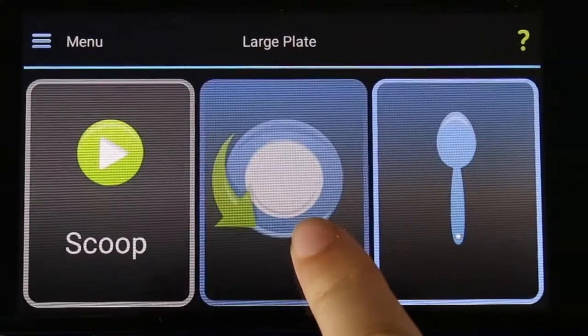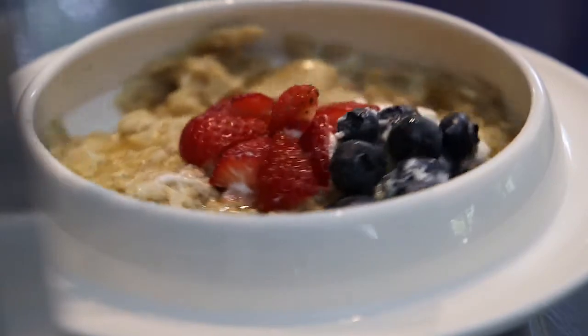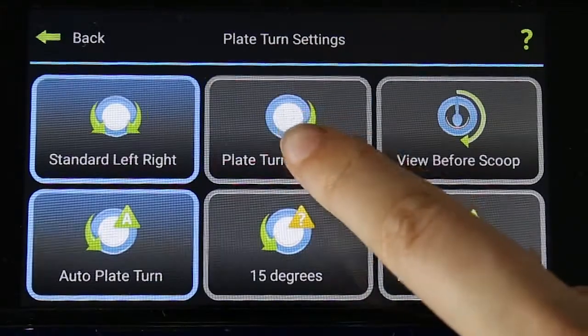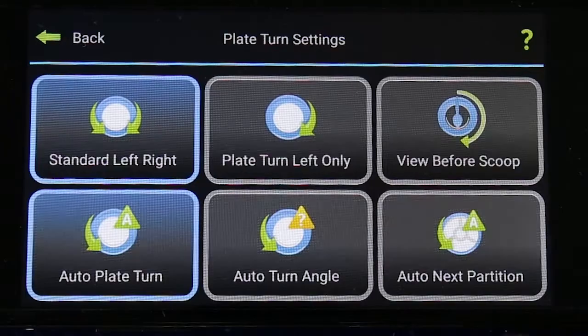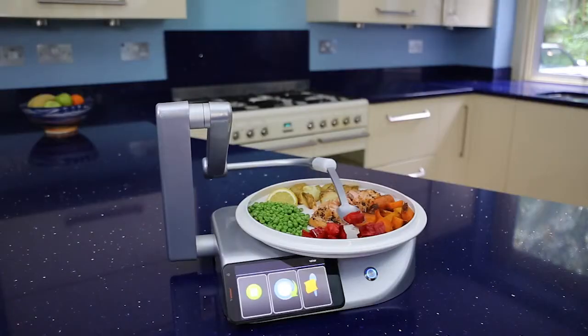The middle button is used to turn the plate to align the food with the spoon for scooping. Usually this is set to turn in alternate directions, but it can be set to turn one way only. The plate can also be set to turn automatically between spoon scoops.